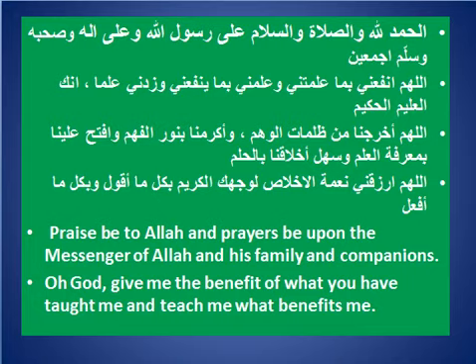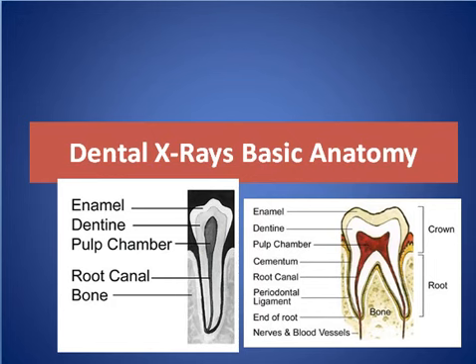My short talk today is about dental X-ray basic anatomy.